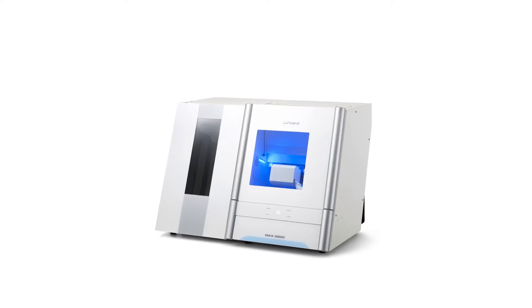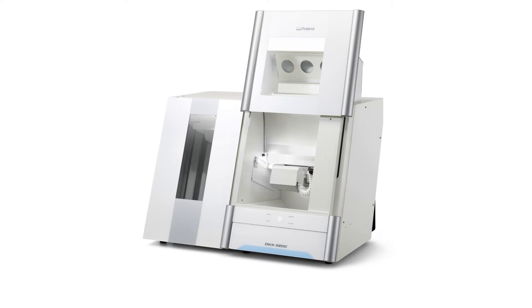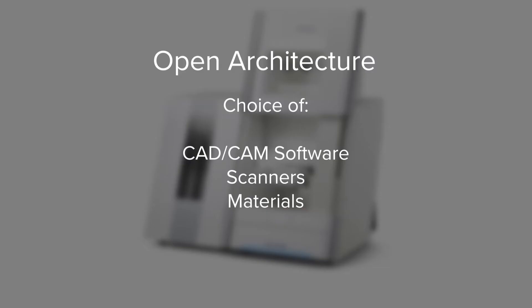For maximum versatility, the DWX52DC features an open architecture, giving you the freedom to work with your choice of CAD-CAM software, scanners, and materials.